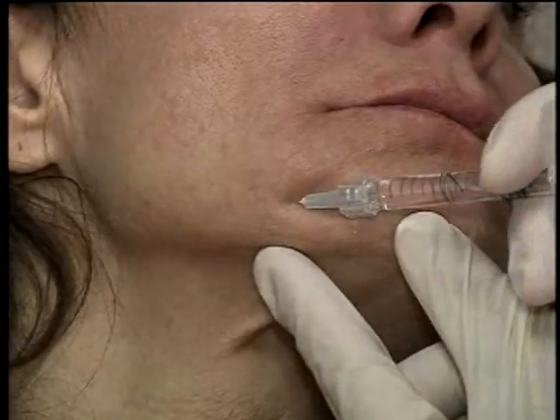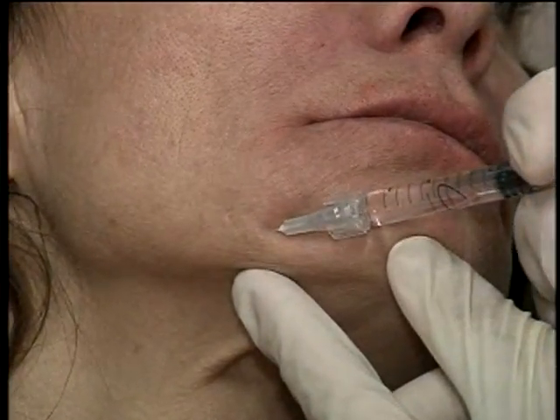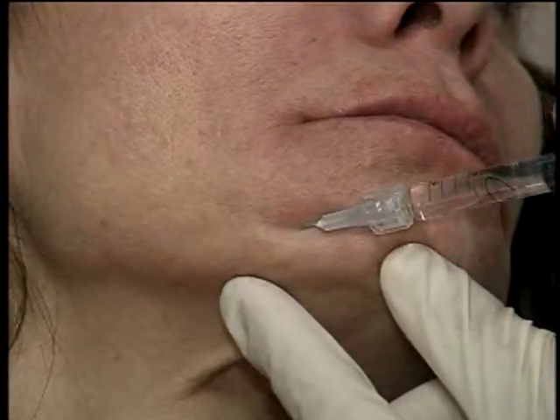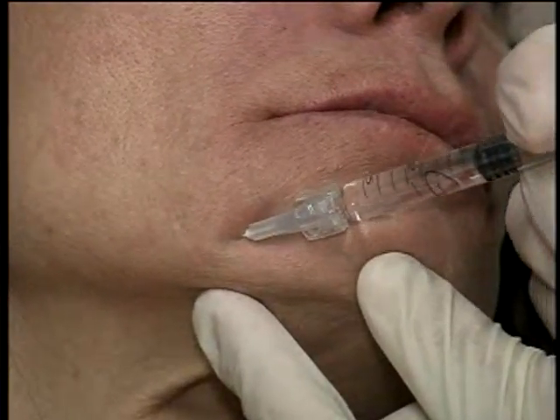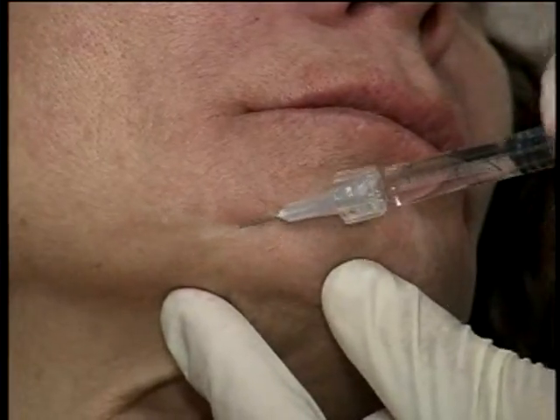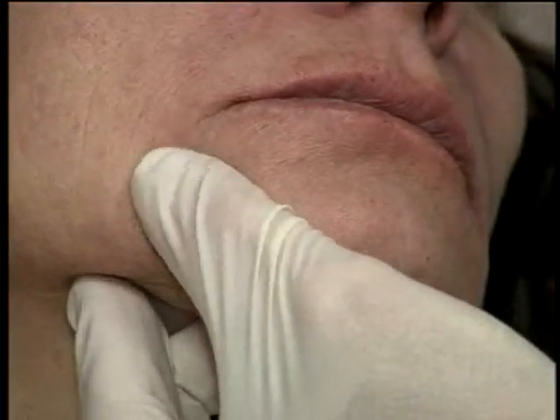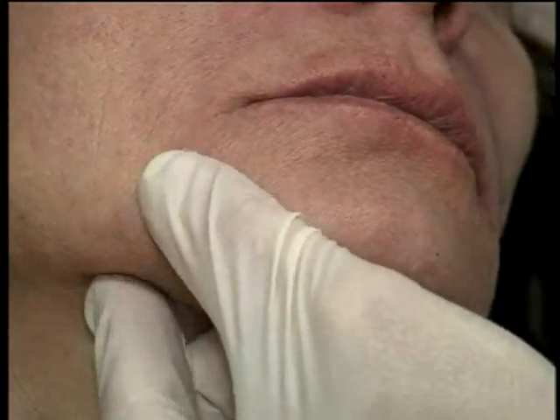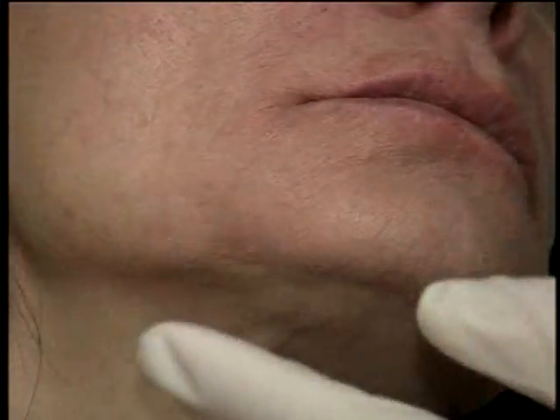I go down, and you want to inject slowly and purposely. Now you want to stay medial to the jowl. If you inject into the jowl, it will cause worsening of the jowl, and it'll actually be an outcome you won't like. So I placed there about 0.2 cc's, and we feel it, massage it into place. And I can start to see that.